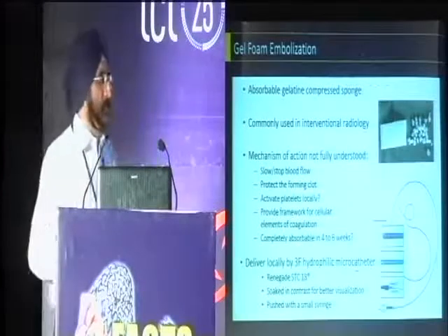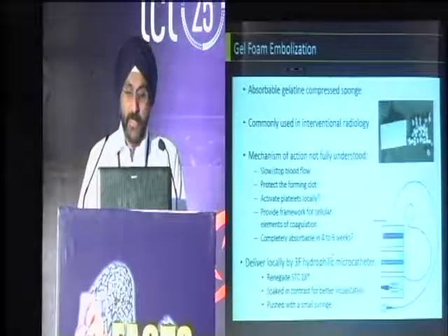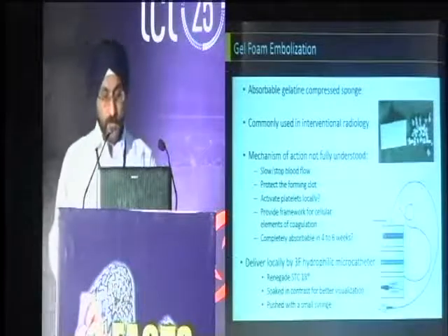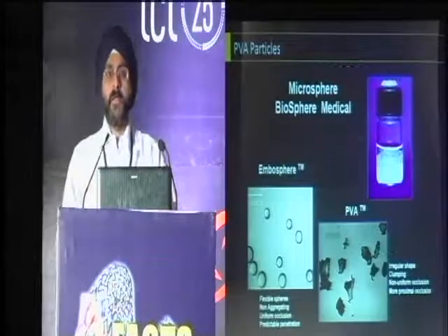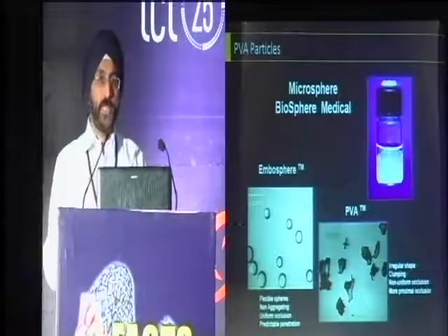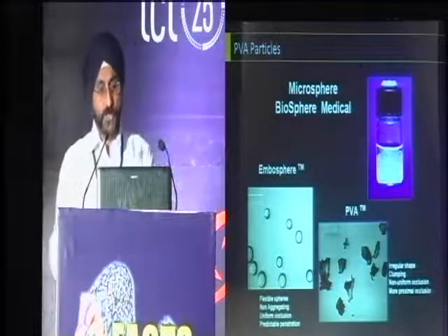Once this gets absorbed and local hemostasis is achieved, maybe you can venture to take up these cases again. Another important option, especially for the distal-most circulation, is PVA particles. Basically, they choke the capillaries and try to prevent any active ooze from the distal circulation.